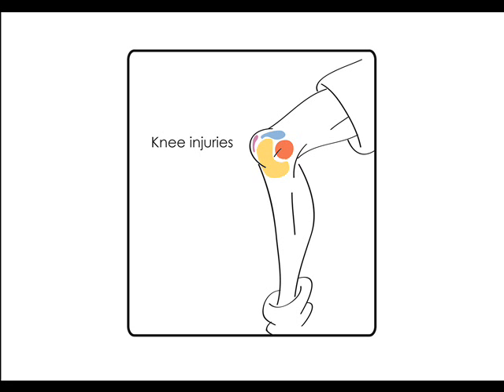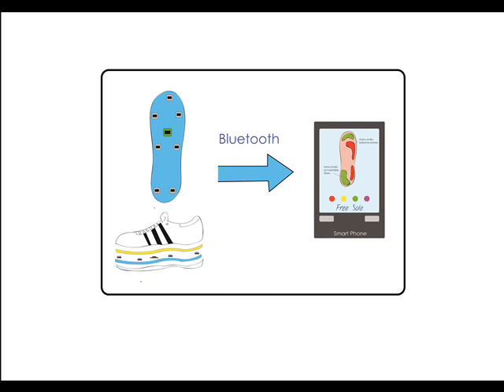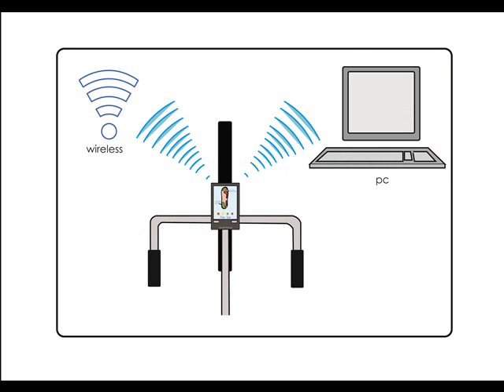It also includes one accelerometer to keep record of the patient's speed and cadence. This is very important because patients can't exceed in the exercise. The Free Sole will collaborate and communicate with a smartphone using Bluetooth. In this way, the user can have visual feedback of his status and relevant information. The smartphone, which will be located in the bike, will communicate with the doctor's computer using wireless internet, sending him convenient notifications and alerts regarding the patient's status and progress.